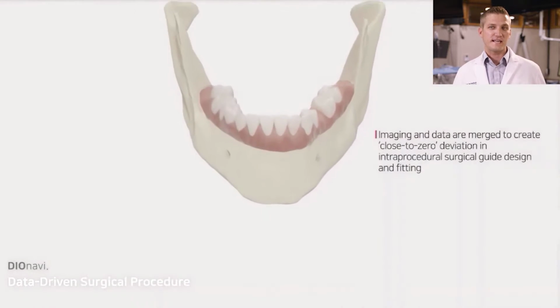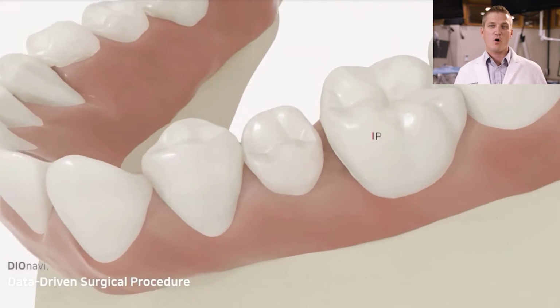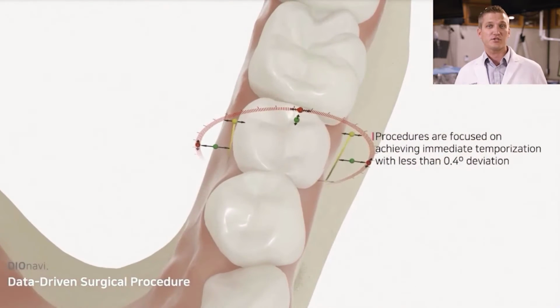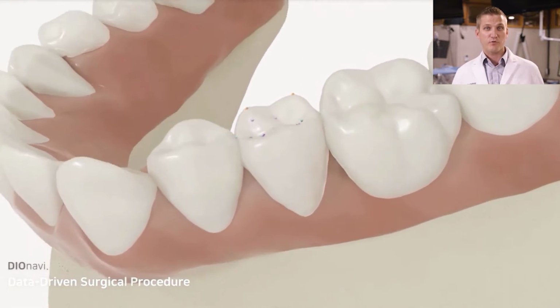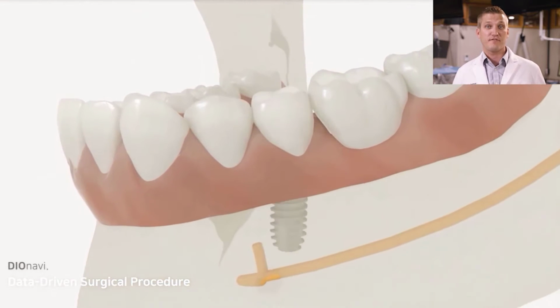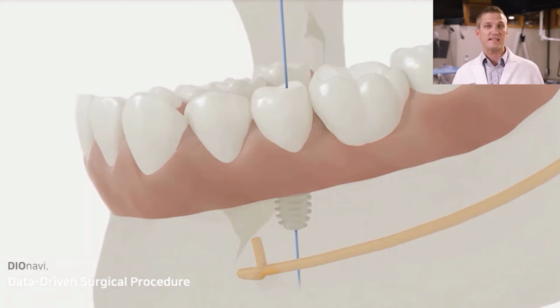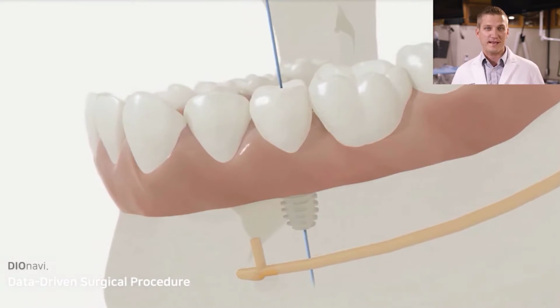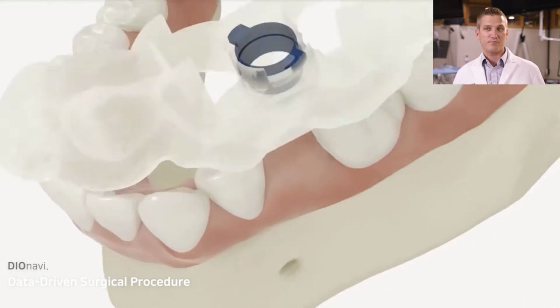So here you're seeing an edentulous spot in the mandible. We're always going to start with a prosthetic tooth first. So a tooth is going to be placed in the virtual world, and we're going to make sure it is in the ideal geometry to match the final restoration. From there, the implant is designed with respect to the anatomical structures around that area, and then, of course, complementing the prosthetic plan of the tooth.